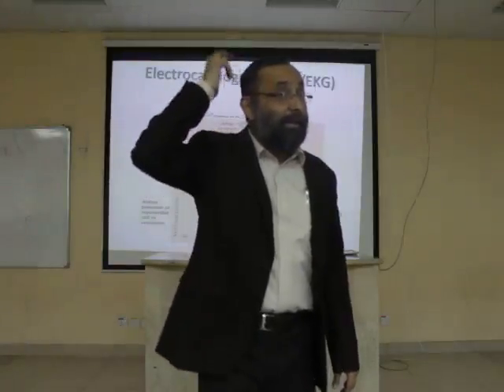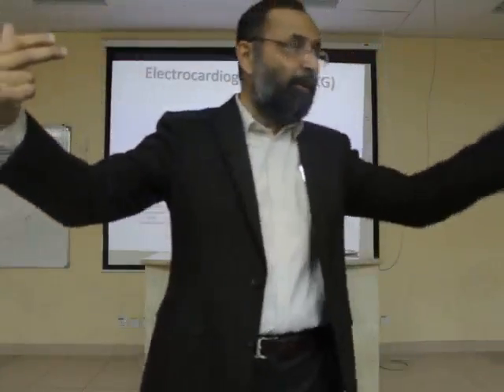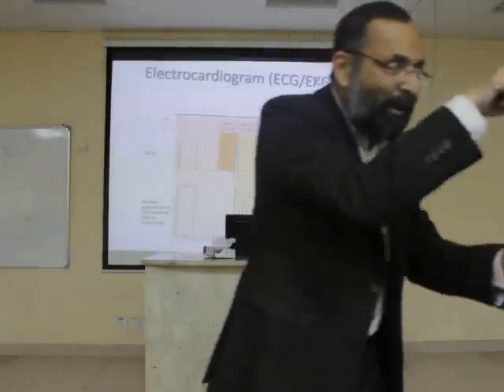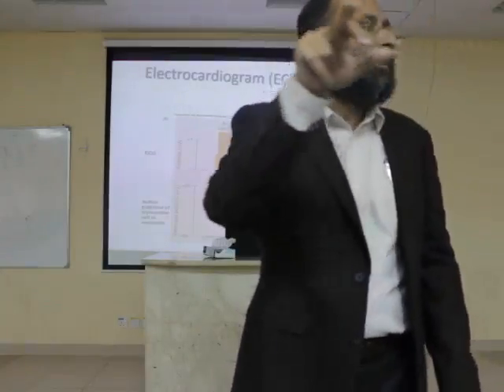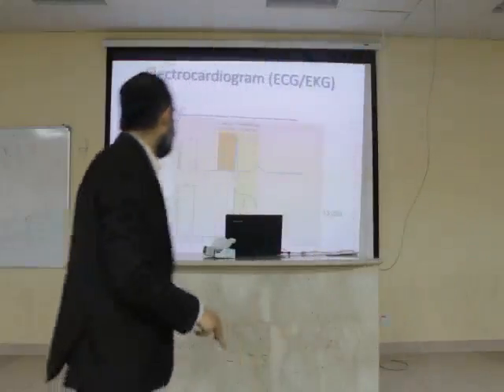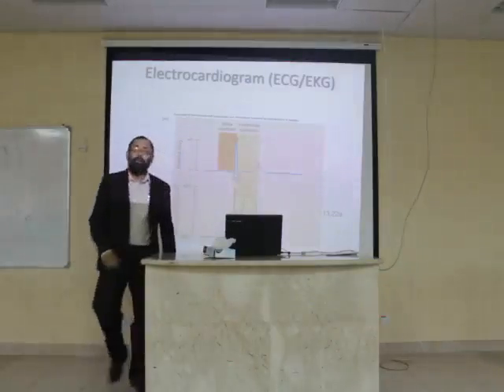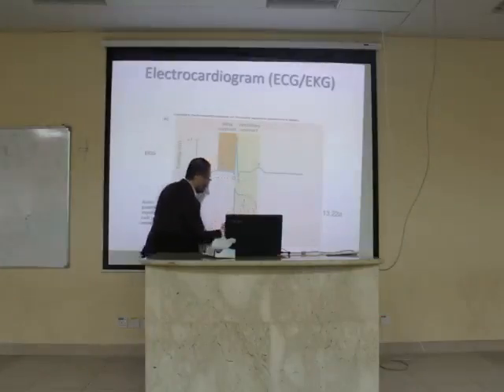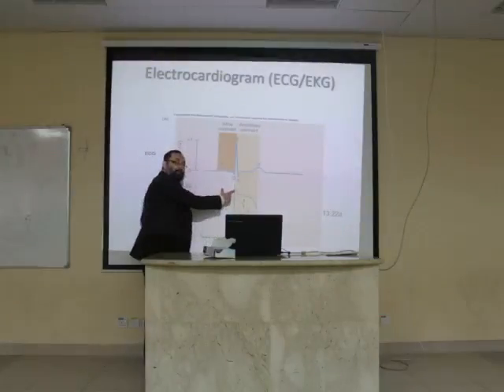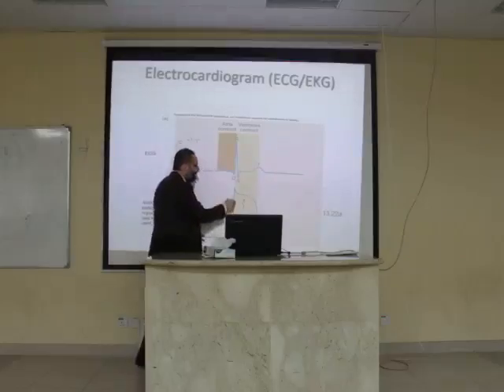The question is, what is the mystery between the ventricular depolarization and repolarization in a straight line? You wonder, where is the impulse, what is the impulse doing and where is it passing when you are trying to understand this line? Yes, match this line with this area of the action potential. Look at this line. This is the action potential graph. What is it showing? Take it as a ventricle. I'm talking about the ventricle. What is this line? Depolarization.